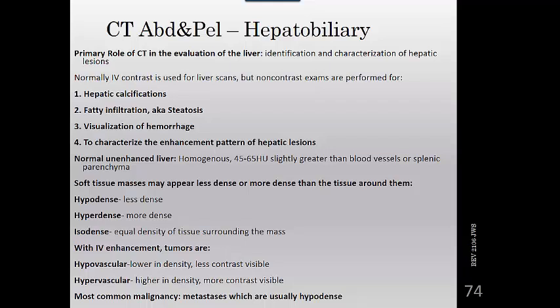Tumors that are hyper-enhancing relative to the surrounding liver tissue are best detected during a late arterial phase. Liver mets, metastases, tend to be hypervascular in the cases of primary tumors of the thyroid or pancreatic islet cells, carcinoid tumors, renal cell carcinoma, some breast tumors, and melanoma. When these hypervascular tumors are suspected, dual phase imaging is often beneficial, but the majority of liver mets are hypovascular and develop from primary tumors of the colon and rectum, pancreas, lung, urothelium, prostate, and most gynecologic malignancies. When these conditions are suspected, images are typically acquired in a single portal venous phase.